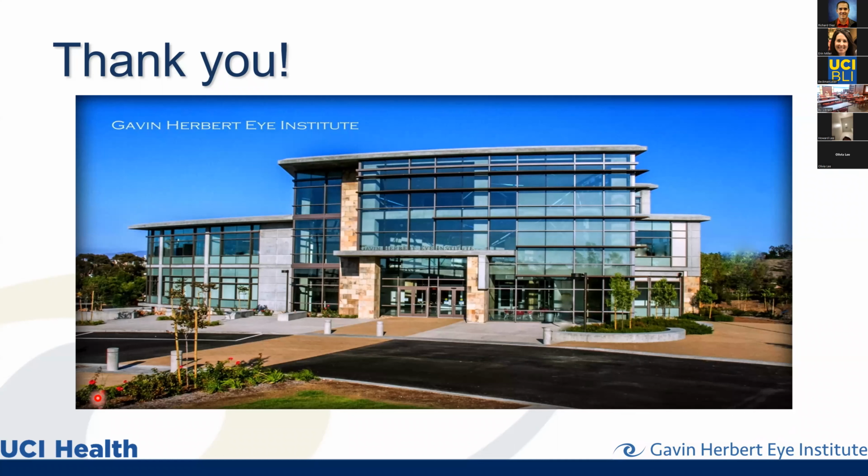But for some of them, we would get 2 examiners. They're blinded to each other, so they don't talk to each other, and they examine the same 3 images. And then we want to make sure there's reproducibility between the 2 of them. And the examiner is always masked to the clinical scenario. So we try to do that. It's very difficult to know that we're getting the same spot again.